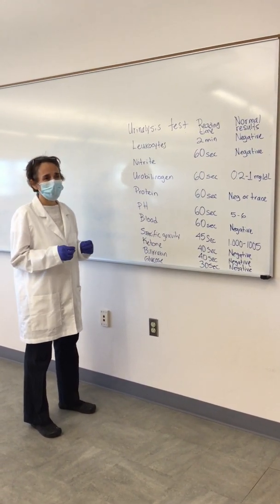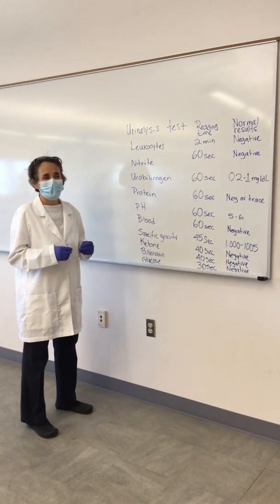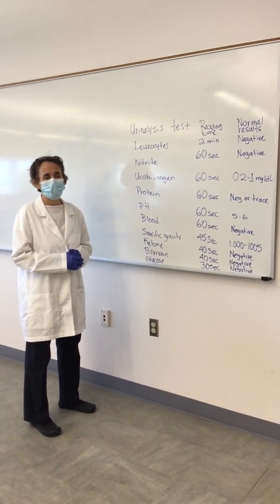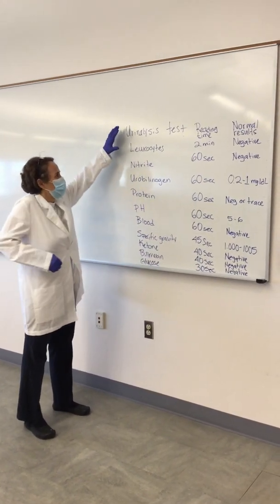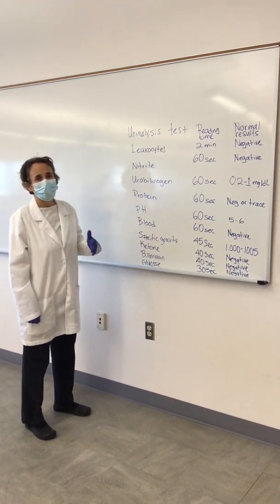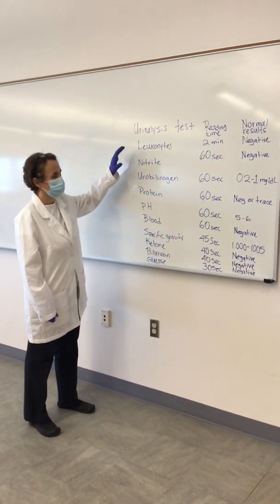So we will be doing this urinalysis with a dipstick, this Multistix 10 G of Siemens, and it has different components. It has 10 different tests, and all of these are for the following substances or parts.